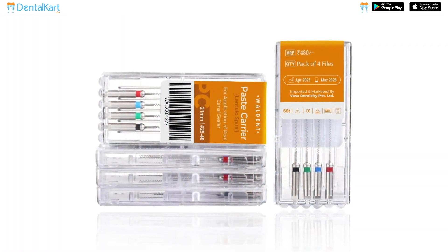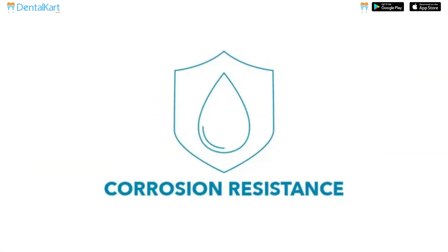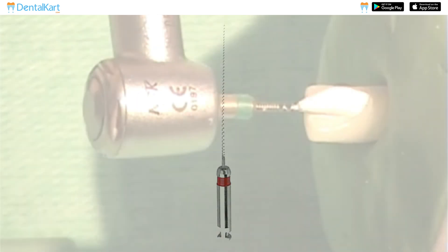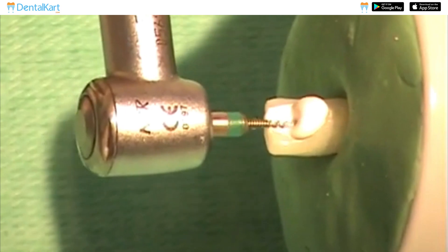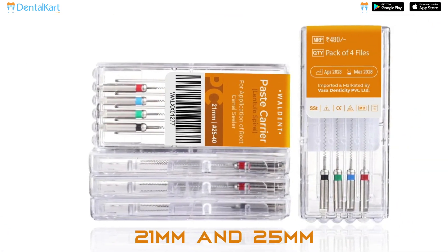The Walden Paste Carrier is made from high-quality stainless steel, making it durable and resistant to corrosion. It is a tapered, spiral-shaped instrument with a unique helical design that facilitates accurate and controlled placement of the filling material, ensuring proper coverage and sealing of the root canal. It is available in 21mm and 25mm lengths.